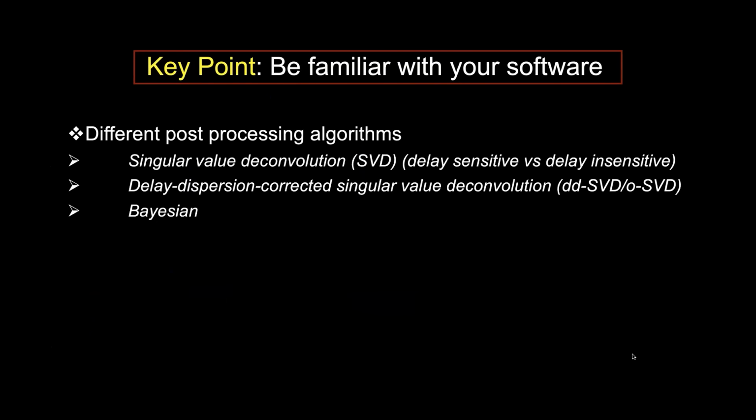So the key point that I would implore you is to be familiar with your own software, whatever your institution is using, because different post-processing algorithms are available. I will not go into the physics, but just know that there is singular value deconvolution, whether it is delay sensitive, delay insensitive, delay dispersion corrected, or Bayesian.